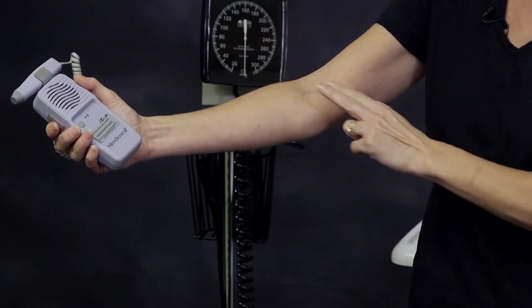A Doppler device is a form of ultrasound transmitter and receiver that is placed over an artery distal to the placement of the blood pressure cuff. When performing a blood pressure measurement in the upper arm, as will be demonstrated in this video, it is common to utilize the radial artery, although the brachial artery is an acceptable alternative. This same technique can be utilized in the forearm, the thigh, and in the calf using the artery distal to the cuff placement.